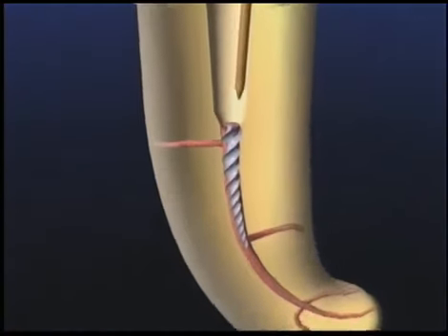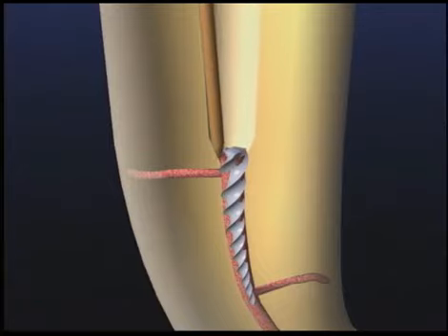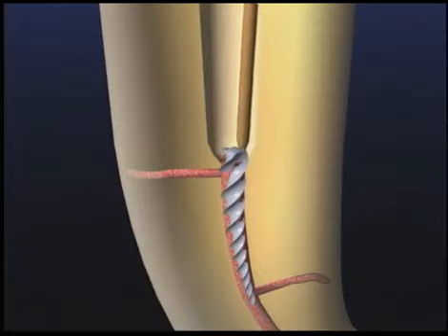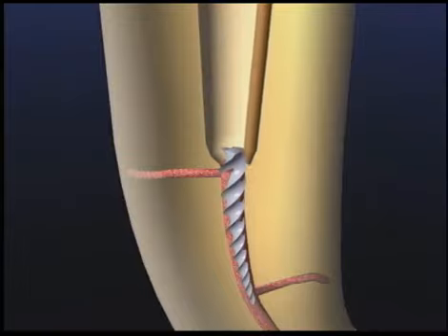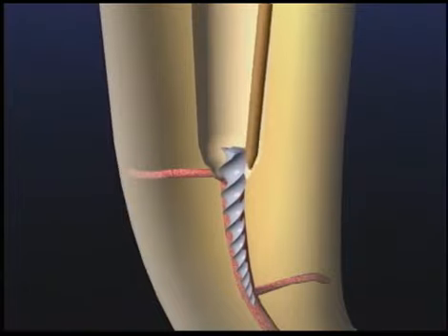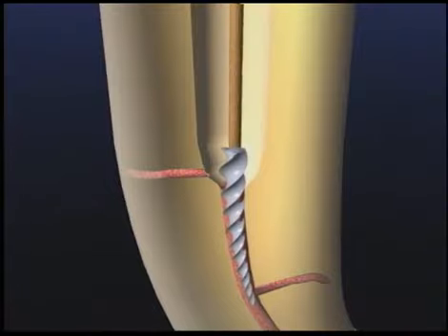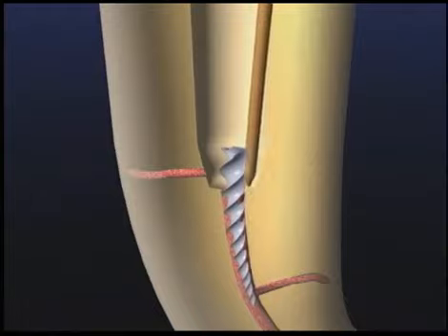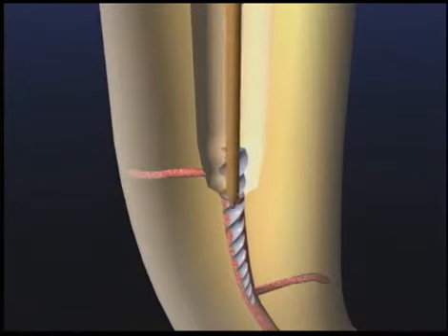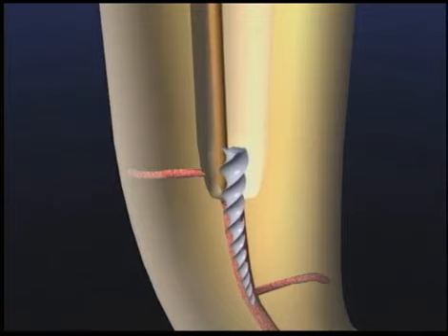Next, we select an appropriately sized ultrasonic instrument that can reach the obstruction. Activate the instrument and move the Pro Ultra Endo tip in a counterclockwise motion around the file, keeping intimate contact between the energized ultrasonic instrument and the broken file. A light touch is mandatory to maximize safety and the ultrasonic tip's efficiency. You'll notice the zirconium nitride coating allows us to sand away minute amounts of dentin as we gently and progressively expose more of the file.